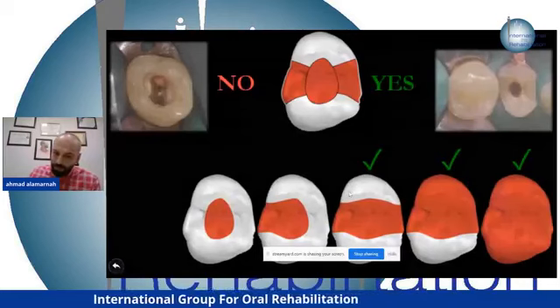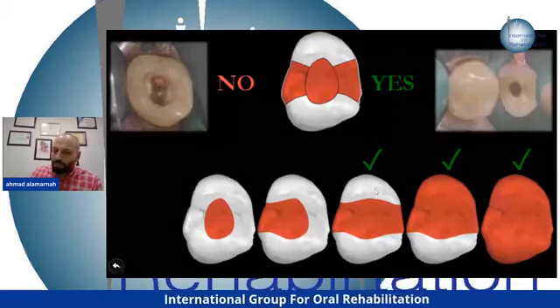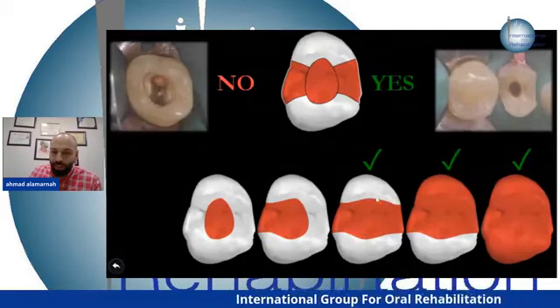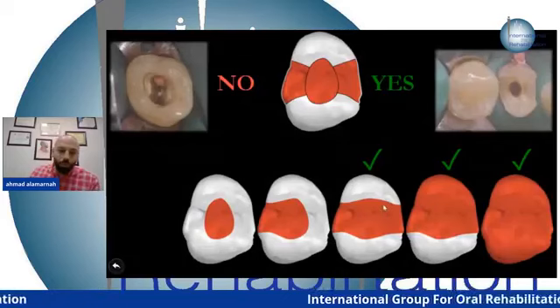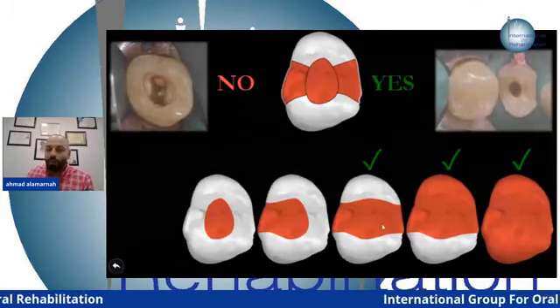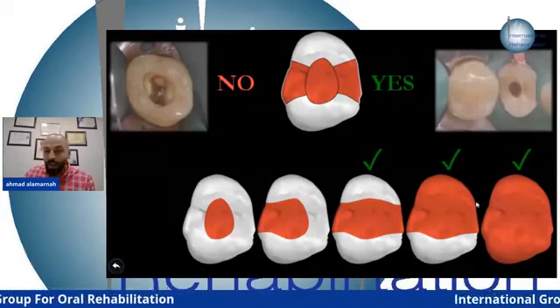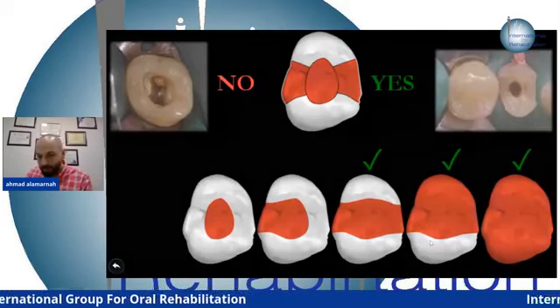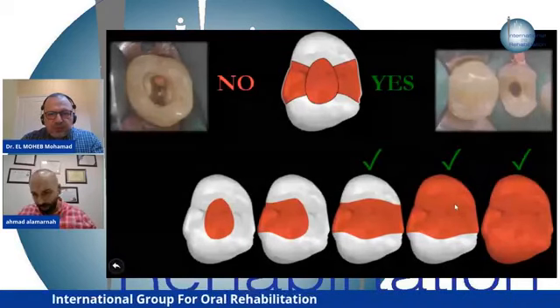Then you have to prepare your tooth after you build it. So you remove like 1.5 millimeter, 1 millimeter from the thickness of this wall, and also from this wall. You will end up with only the restoration hanging out from the root, and you put your crown above it. So it's very weak. Why not use the remaining tooth structure, the 2 millimeter of solid enamel? This is solid enamel. Use your solid enamel, and it will last longer than the crown. At this one, I also don't use a crown. I use something called a tabletop. If it's 2 millimeter, I keep it here, and I do some beveling here, and I do a tabletop with composite or with ceramics.